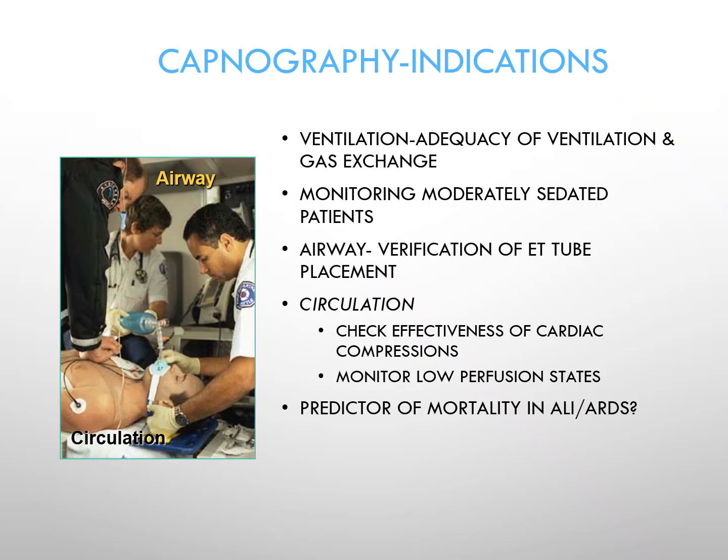In addition, and as a point that I just alluded to, is monitoring patients who are moderately sedated. The term used to be conscious sedation, but we've gotten away from that. Generally speaking, when medication is administered to sedate a patient to facilitate, say, an endoscopy, a colonoscopy or a bronchoscopy, those medications are given to achieve this moderately sedated state, or like a twilight sleep.